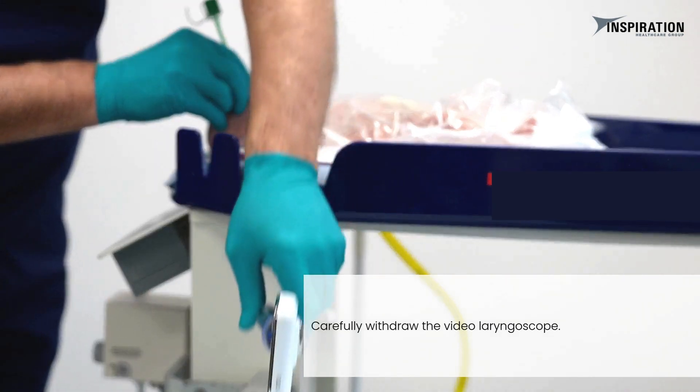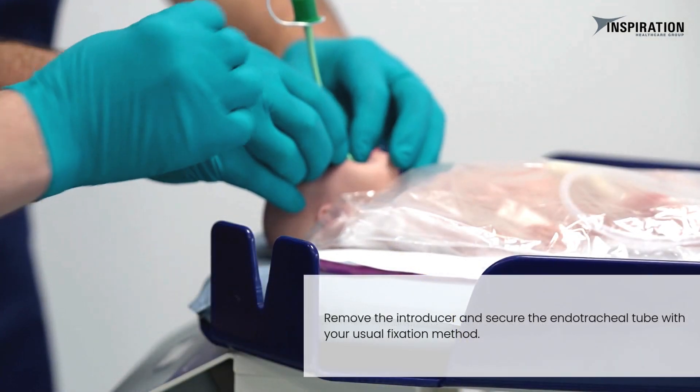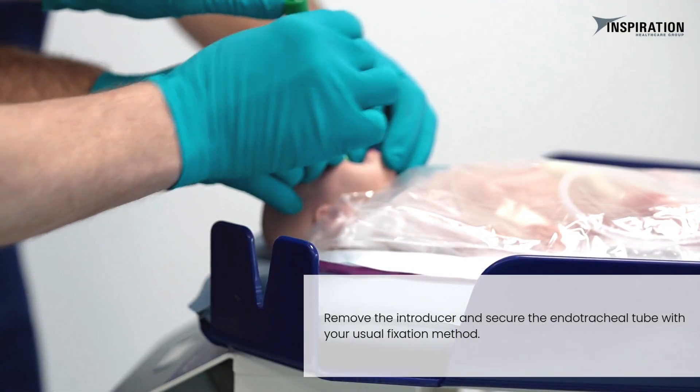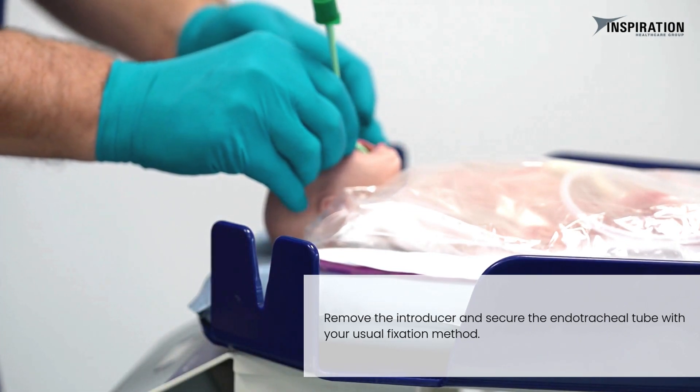Carefully withdraw the video laryngoscope. Remove the introducer and secure the endotracheal tube with your usual fixation method.